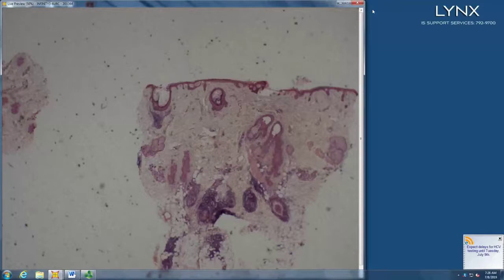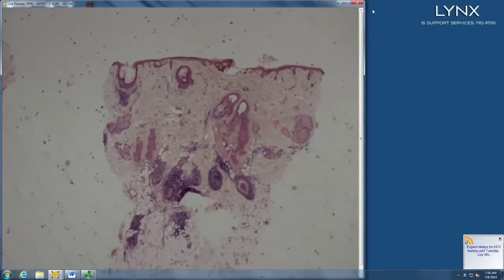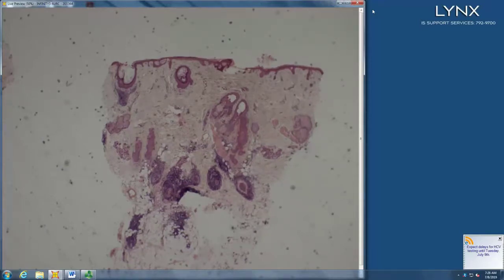So we have a punch biopsy, some deeper infiltrates around the adnexa. And so it's around what portion of the adnexa? I mean, they look like hair follicles. And what bit of the hair follicle? Like the bulb. The bulb! So what owns the bulb in terms of infiltrate? I mean, you could think of alopecia areata, and then you have to think of syphilis. And those are the key two, right? Alopecia areata and syphilis.